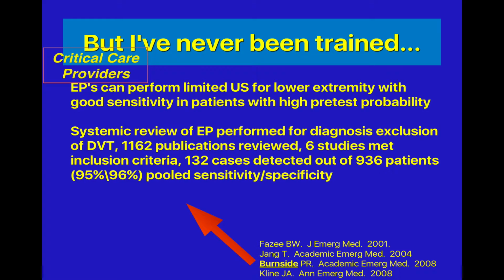Then in the emergency department, anybody who was getting an ultrasound scan over the next 6 months or however long the study was, the medical student would go and do their limited DVT scan. Obviously, they missed a few, but if they were positive, then it was almost 99.8% that the official ultrasound was also able to see a DVT.